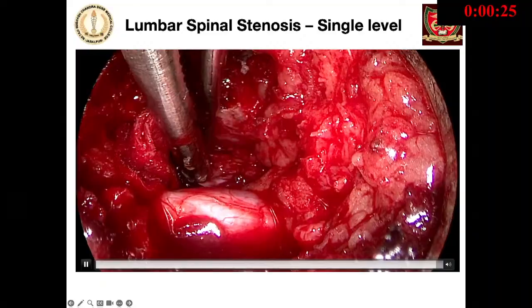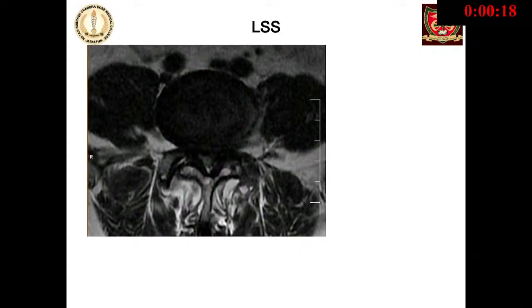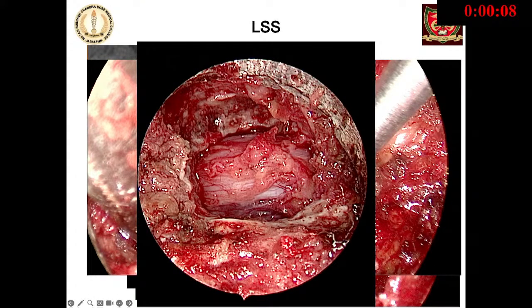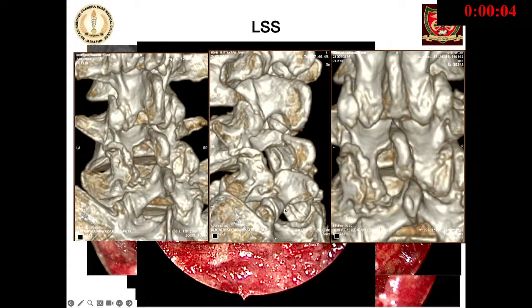Drilling of the opposite side facet. And you can see the opposite decompressed root. A good view of the decompressed thecal sac was done.